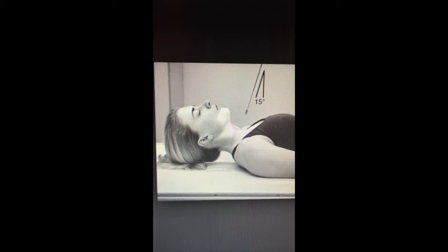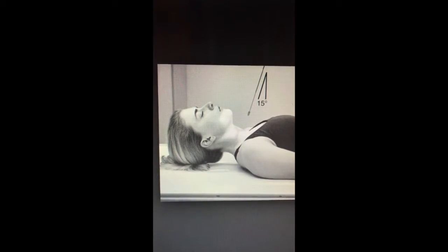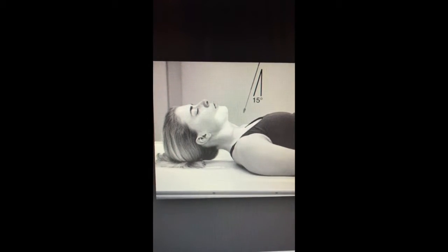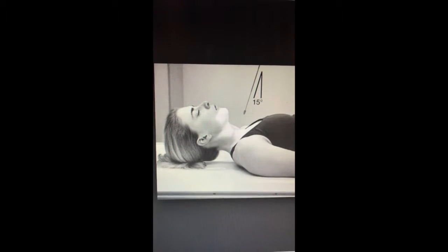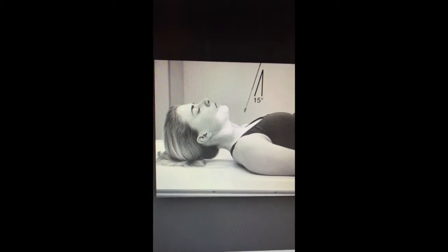The patient should hold the breathing in order not to have any movement. The chin needs to be extended in order not to superimpose the spine. Some of the factors that would need to be used in this position will be like 75 to 85 kVp.